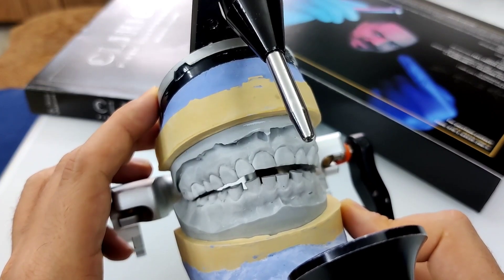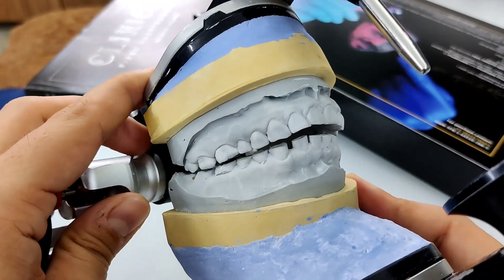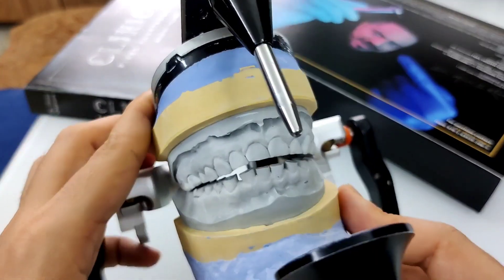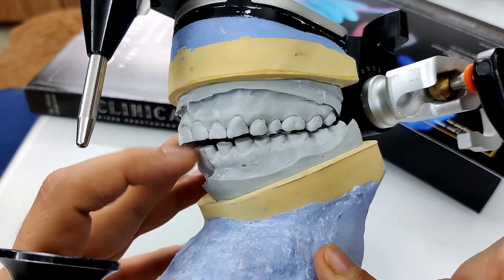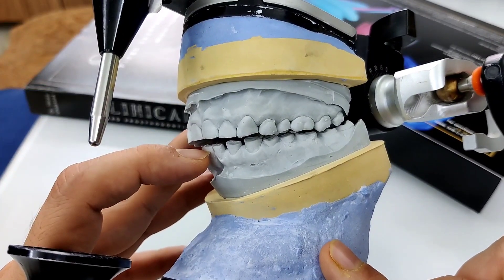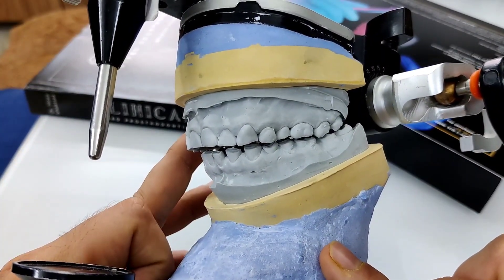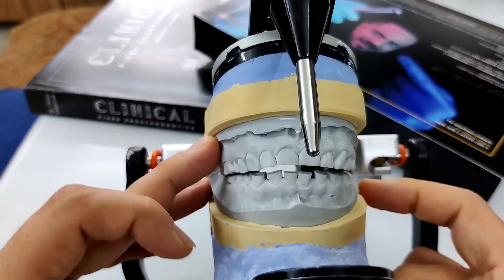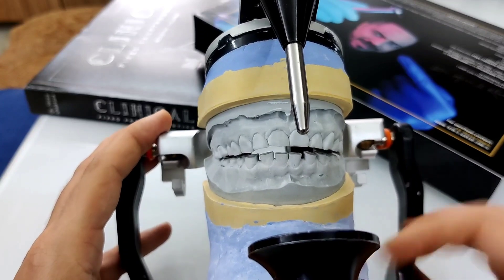First, go ahead and deprogram the mandible, record the centric relation, mount it on a semi-adjustable articulator, and try to identify at RCP what is the amount of space available for you. Second, look at where the lower incisor is in relation to the upper — can you get the desired anterior overlap vertically and horizontally? We read this as overjet and overbite. If you have that, as in this case, there is no need to raise the vertical dimension at all. Simply work at the first point of tooth contact.